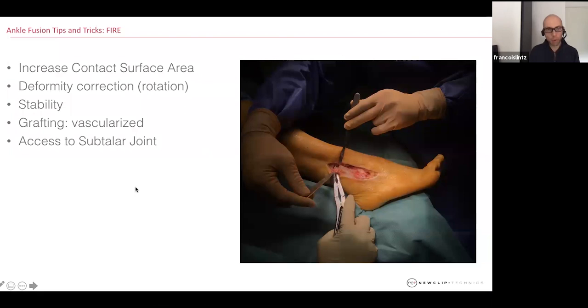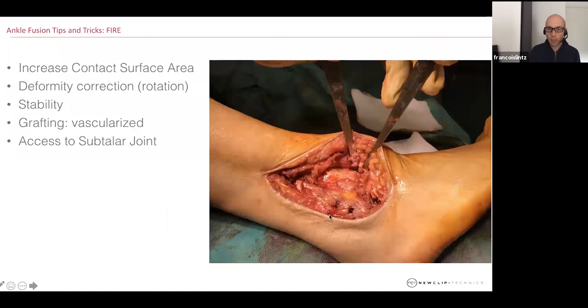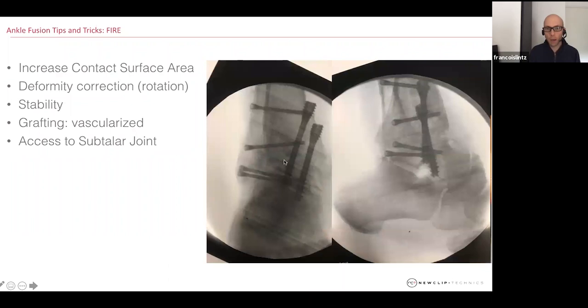Here are just a few pictures of this case and the last one with the two screws in place. In this case, this was a traumatic case. There wasn't a great deal of bone loss. We had to resect a little bit anteriorly, and we released the Achilles tendon, we released posteriorly, but we didn't have to augment the bone. We didn't have to do a structural graft. So the construct was really solid as soon as we put in those two screws. Then closing the fibula on top of it, like a biological plate, increases this stability even more.